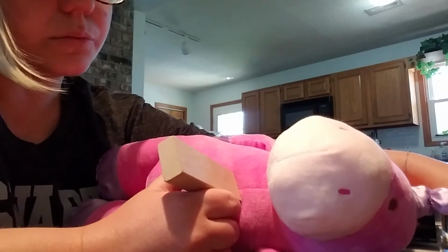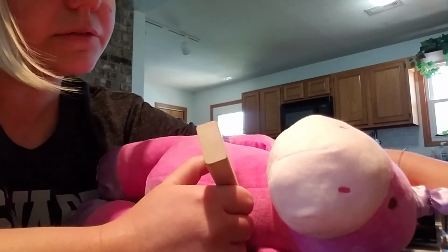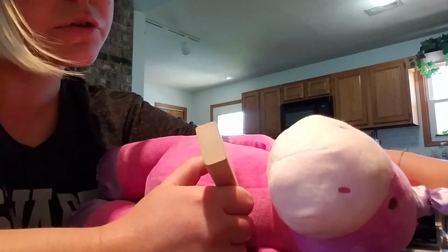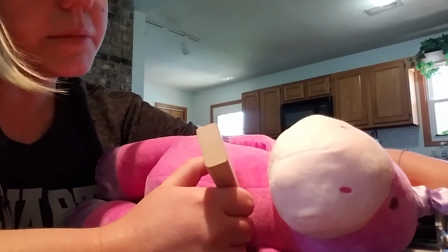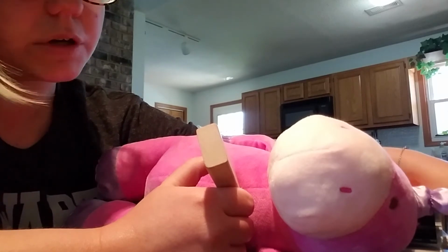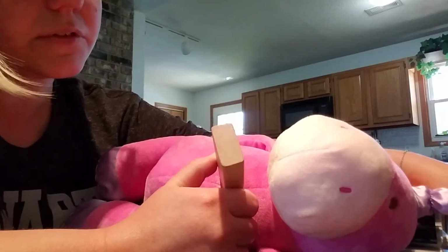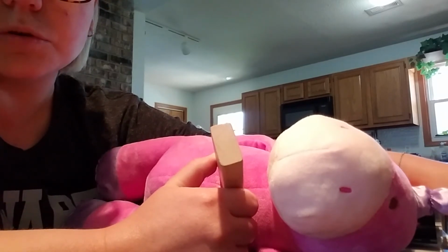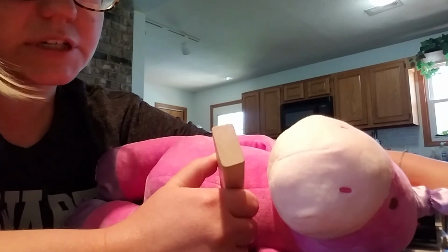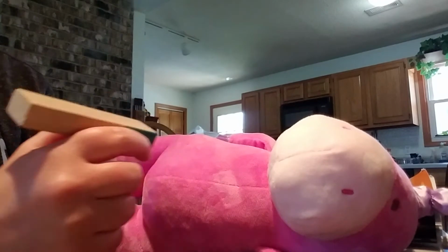And then you would pan inferiorly for your mitral valve, where you'll do cine loop, color compare, and M-mode. Inferiorly again, you'd have your left ventricle at papillary level, and then you would do your cine loop, your color, and your M-mode. Inferiorly again, you would be at your apex of the heart, where you would do your wall motion, just cine loop. And then you would move on to your apical four-chamber.